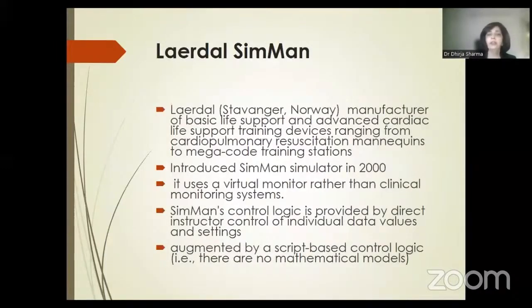Laerdal SimMan is, they are manufacturers of basic life support and advanced cardiac life support training devices, and all of us are most familiar with these mannequins. They are used for code blue training. Then Laerdal SimMan was introduced in 2000. It has a virtual monitor rather than a clinical monitoring system. So it is a cheaper version, and easier to operate also, and its control logic is provided by direct instructor control of individual data values and settings. It can also be augmented by a script-based control logic.